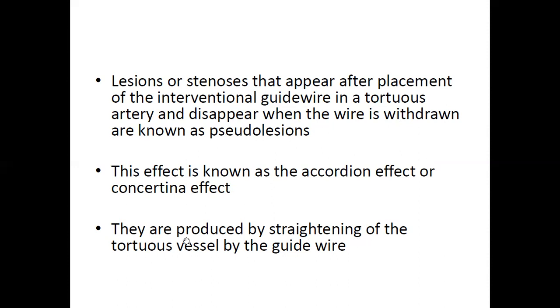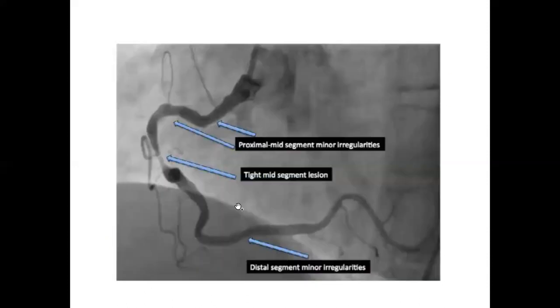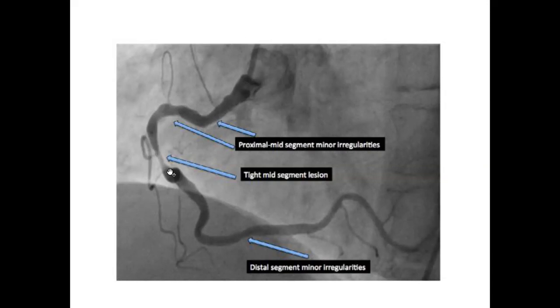They are produced by straightening of the tortuous vessel by the guide wire. Here is an example of a concertina effect. This is from a normal routine coronary angiography — you can see this is a right coronary artery. The mid segment is tortuous, and there is a tight mid-segment lesion when compared to the proximal and distal portions, which show only mild irregularities.